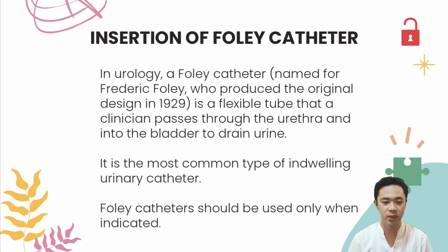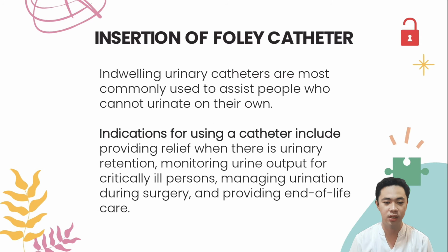Foley catheters should be used only when indicated, as use increases the risk of catheter-associated urinary tract infection and other adverse effects. Indwelling urinary catheters are mostly used to assist people who cannot urinate on their own. Indications for using a catheter include providing relief when there is urinary retention, monitoring urine output for critically ill persons, managing urinary during surgery, and providing end-of-life care.